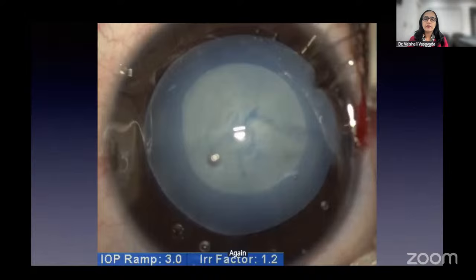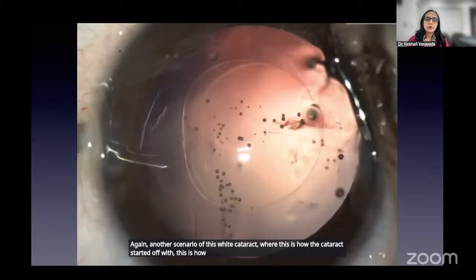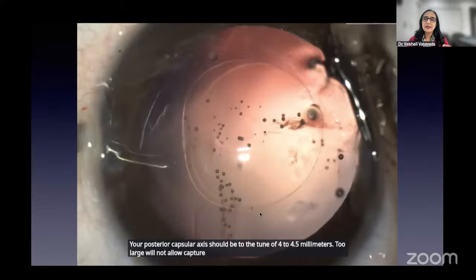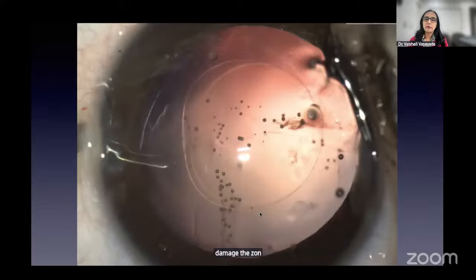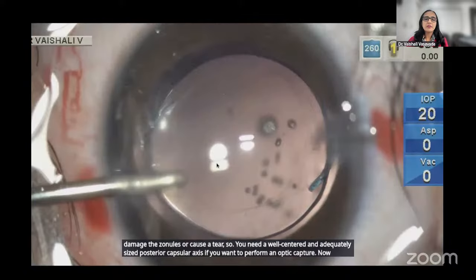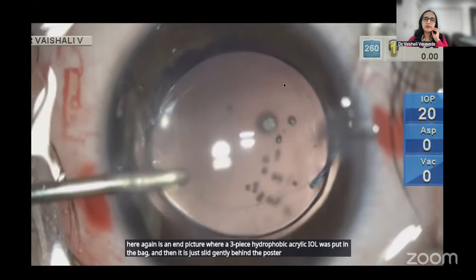Again, another scenario of this white cataract, where this is how the cataract started off. This is how we performed a manual anterior and posterior capsulorhexis. Again, if you want to do a capture, your posterior capsulorhexis should be to the tune of 4 to 4.5 millimeters. Too large will not allow a capture, and too small also you are likely to damage the zonules or cause a tear. So you need a well-centered and adequately sized posterior capsulorhexis if you want to perform an optic capture. Now here again is an end picture where a 3-piece hydrophobic acrylic IOL was put in the bag and then it is just slid gently behind the posterior capsulorhexis margins.